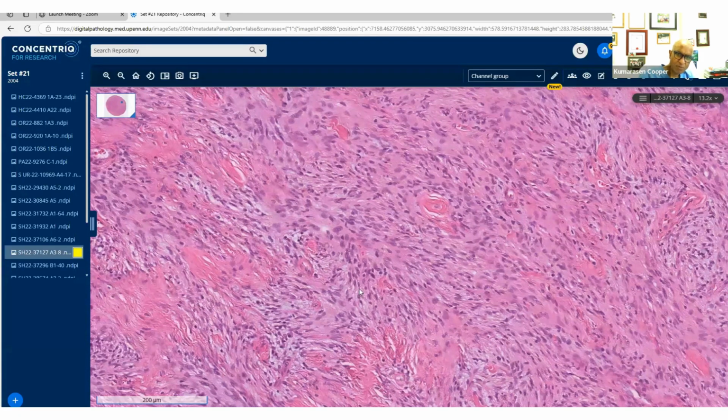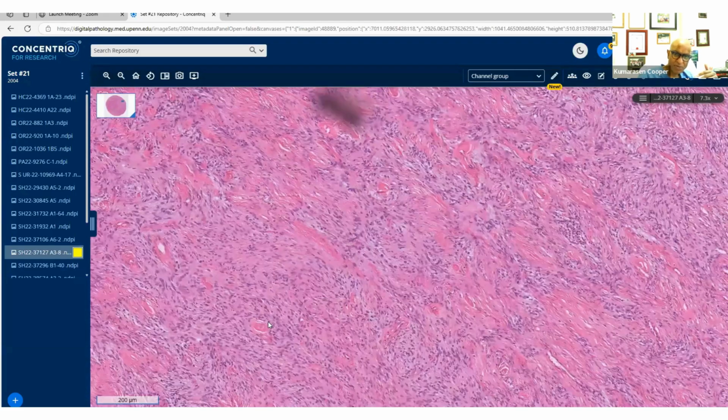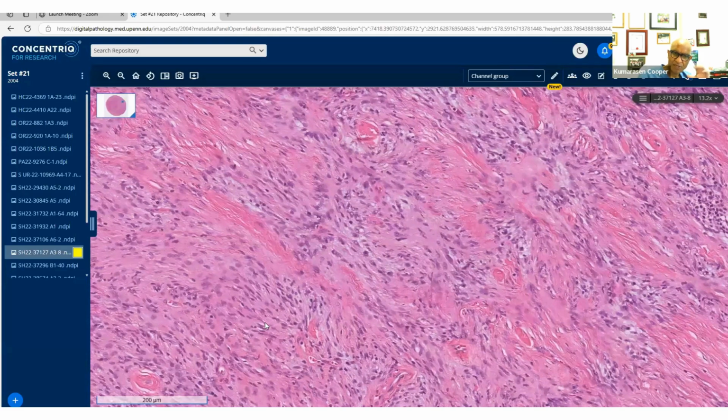If you wanted a little more in-depth investigation, you could do the RB1, and RB1 is lost in myofibroblastoma. That's retinoblastoma 1, so that's helpful as well. So we've got fibroblastic, we've got myofibroblastic. And then I asked myself, could this be nerve sheath? And nerve sheath, like I said, there was some palisading. I think there's some whirling and there's some hyalinized vessels.